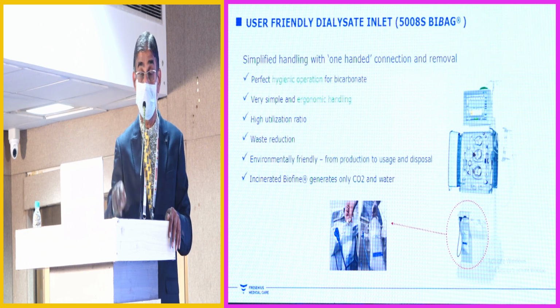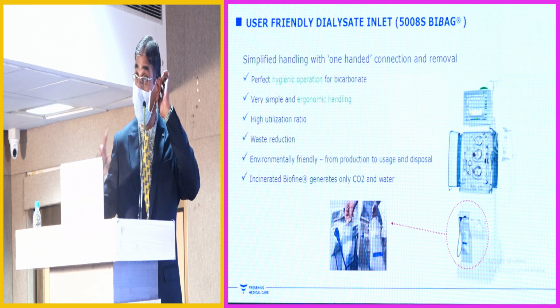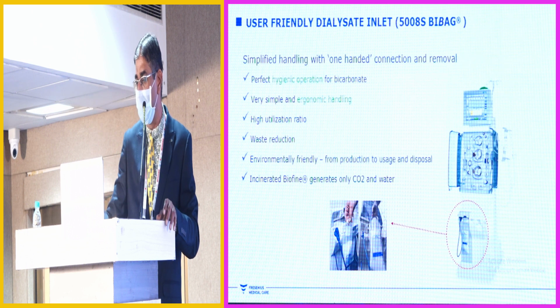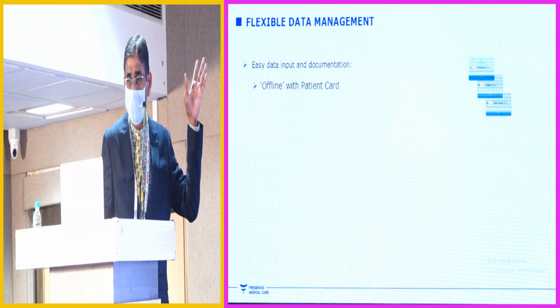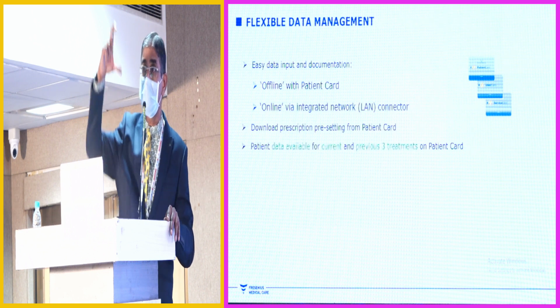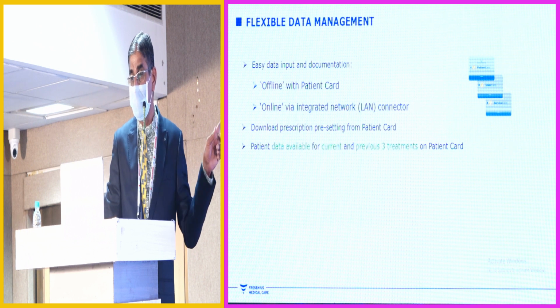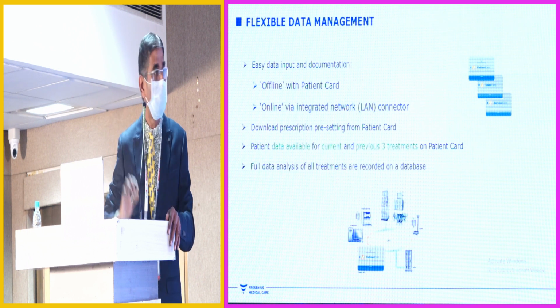You need to be by the side, monitor the conductivity, because based on the conductivity only, whatever is going into the patient will be decided. I know it will give you an alarm if it goes low. You cannot adjust like the normal other dialysis machine where they'll go and raise it even to 14.6, 14.9. No, in this you can't. You have only probably 0.2, you can go up, 0.2, you can come down.